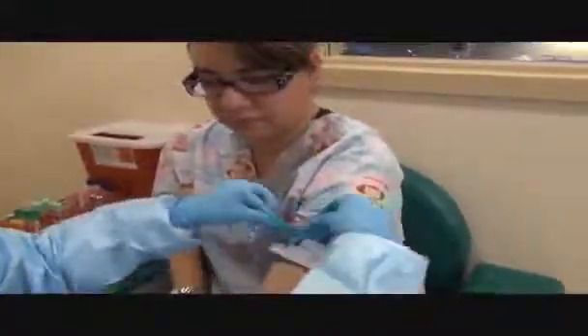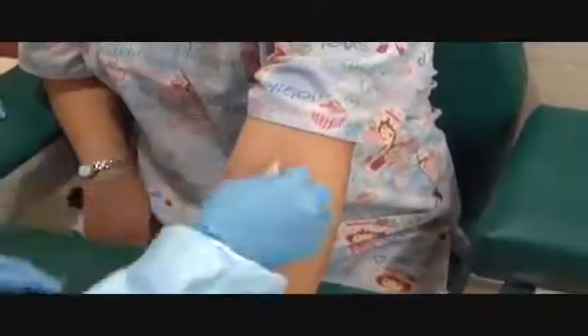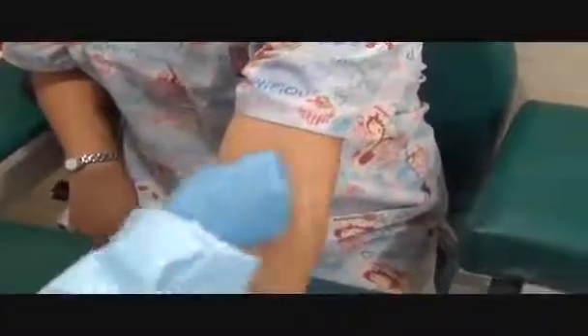Okay, I'm tying the tourniquet four inches above the site. Make a fist. Cleaning with alcohol, wiping down, flipping it over, counter clockwise, concentric circles outward, increasing in size.